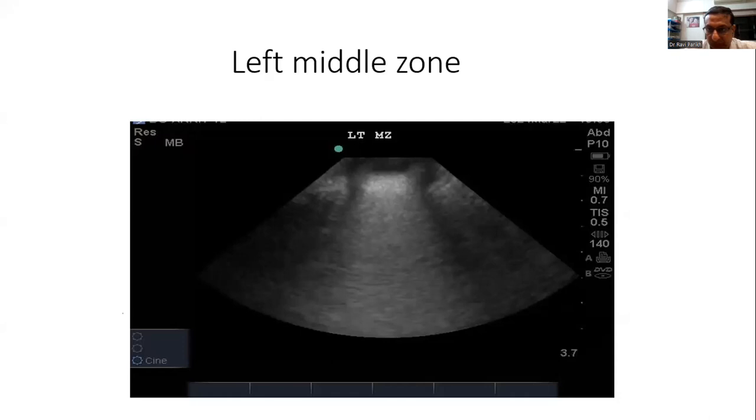the pleura is very thick, very blurred. And normally what I'd say is, I'm just looking at the density of the pleural layer here. And the question is whether you'd have an element of subpleural consolidations there, which naturally are difficult to see because the frequency that we're using is giving us good depth penetration. My gut feeling is if you'd used a higher frequency, you'd probably be able to see them. So this, for me, would fit with a diagnosis of RDS at this particular point from your clinical correlation. And again, it just goes to show that with dichorionic diamniotic twins, the environment for one twin may be quite different from the environment of the other twin.